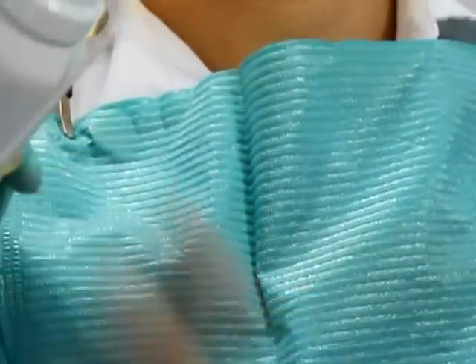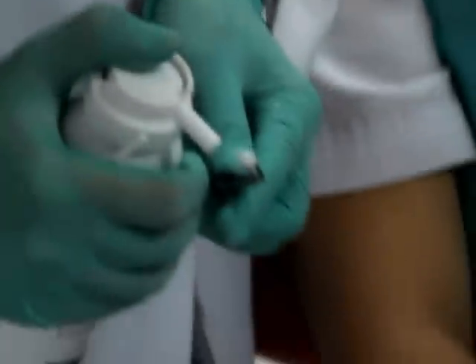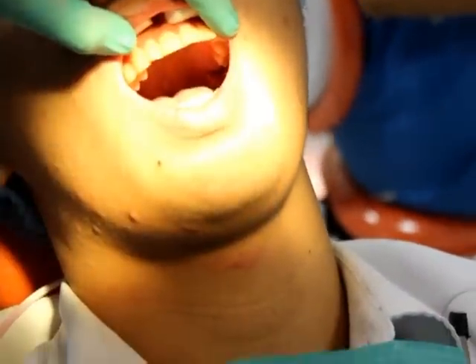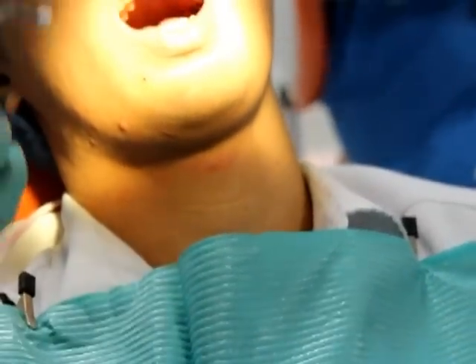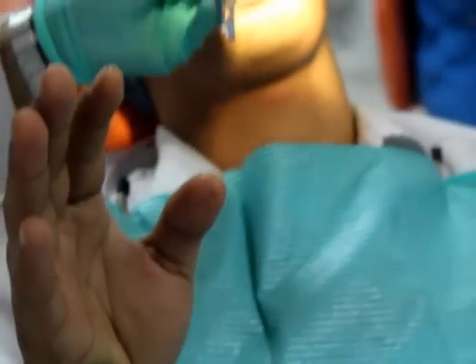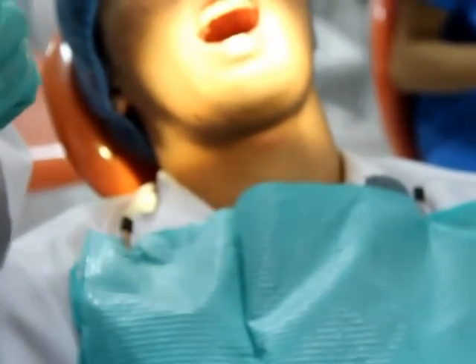Okay, let's see how. So instruction again. I'll put something cold on your tooth. If you feel it, raise your right hand. Once you don't feel it anymore, you put it back. So shake it well, spray, then put on the contralateral, 1-1. So what was the reading? The patient felt it at 1. When I place it, immediately raises the hand. I remove this and then puts it back.